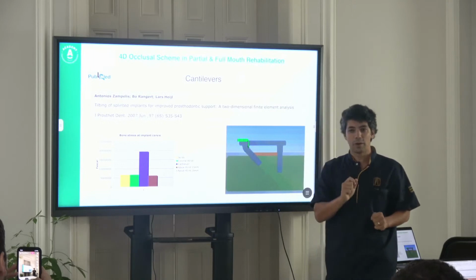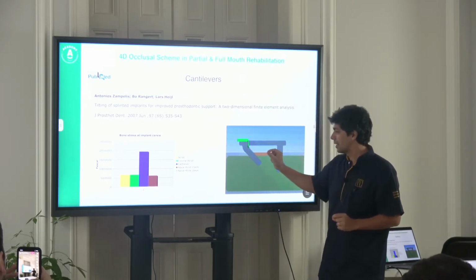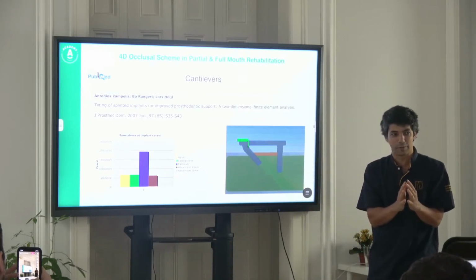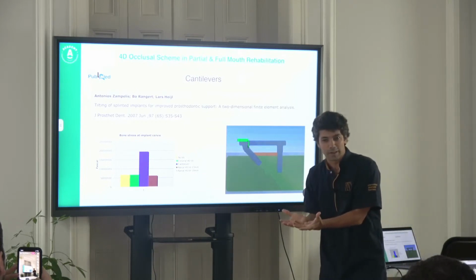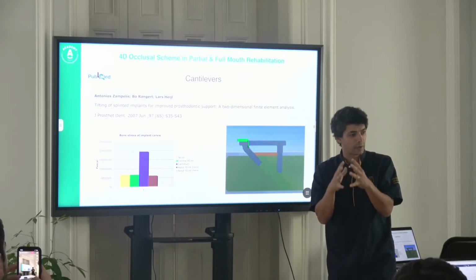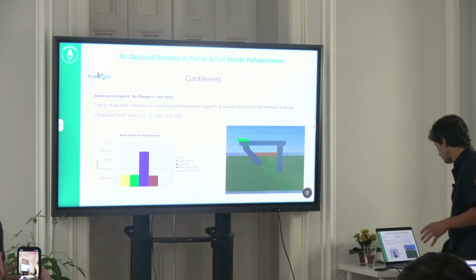But what you need to understand here is that if we supported this framework differently, forget if it's tilted or not, the results would be the same, okay? So the issue here is that we need to avoid cantilevers. We really need to avoid cantilevers.